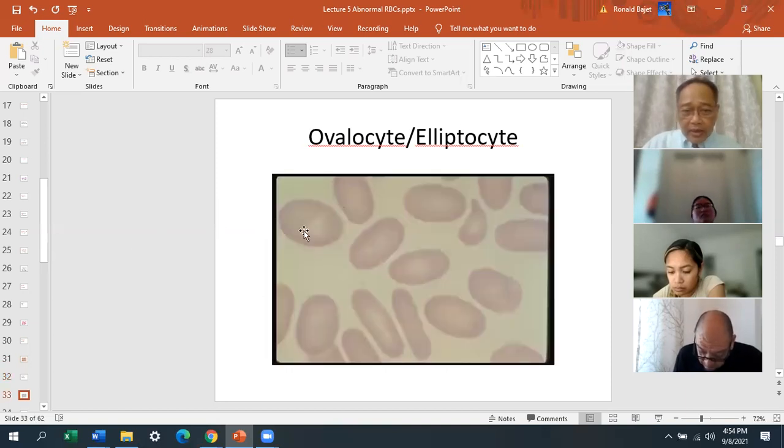Okay, so here, these egg-shaped red blood cells, obviously these are not normal red blood cells, and then here are elliptocytes. Ovalocytes here and elliptocytes here. If you have a normal smear and everything looks round, and then occasionally you'll see these large ovals, that's another good indication. It's reportable that you're seeing oval macrocytes. These cells are macrocytic, they're big, but in the presence of normal red blood cells, and obviously there are not too many normal red blood cells here. If you see these large oval shapes, oval macrocytes are reportable, and they are what's actually seen in iron deficiency anemia, or I'm sorry, not iron deficiency, the B12 folate or pernicious anemia.